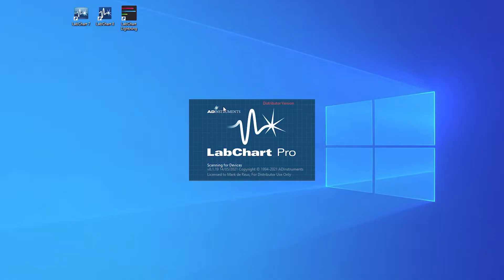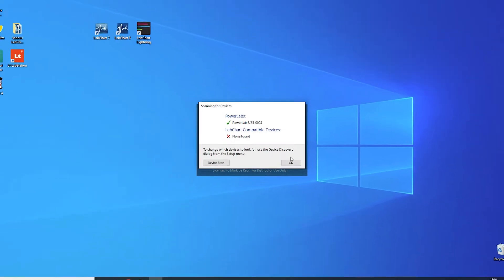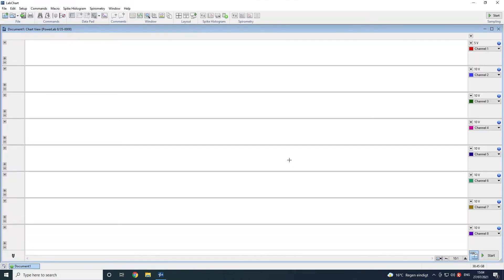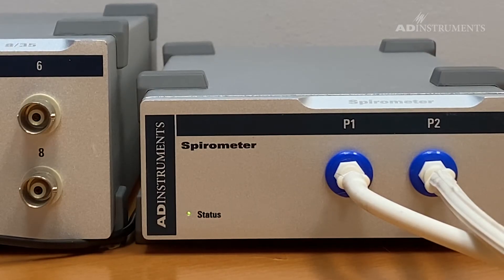Start LabChart. When the spirometer amp is correctly detected by LabChart, the status light will turn a solid green.